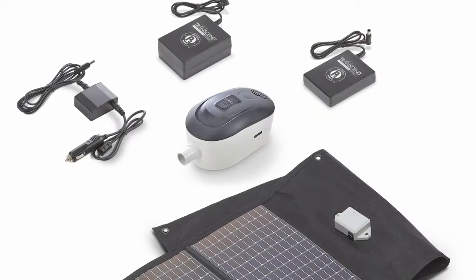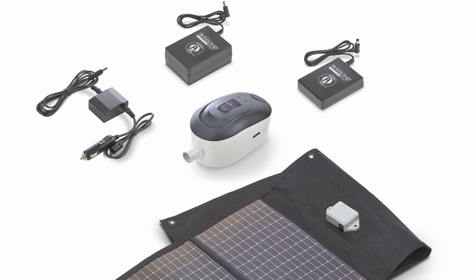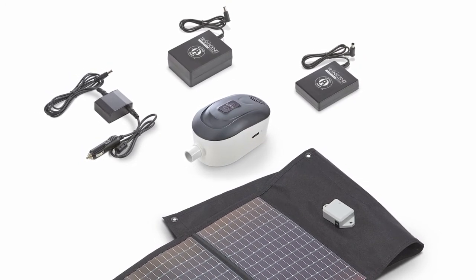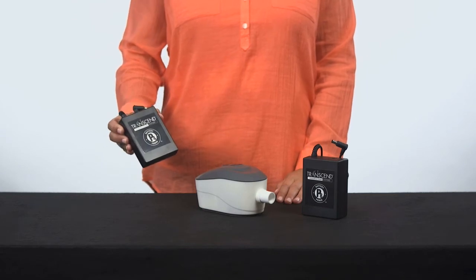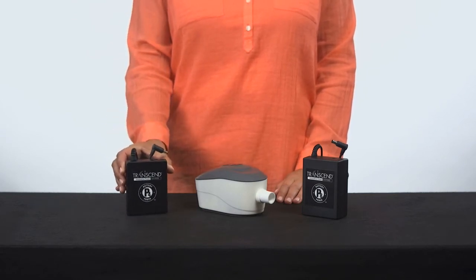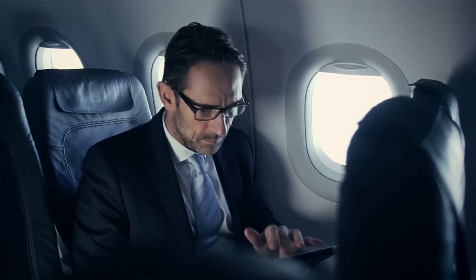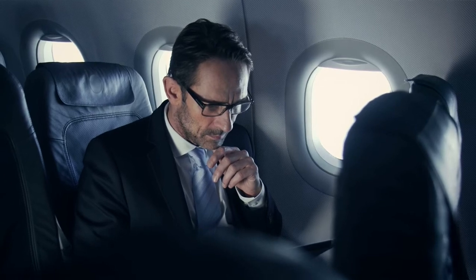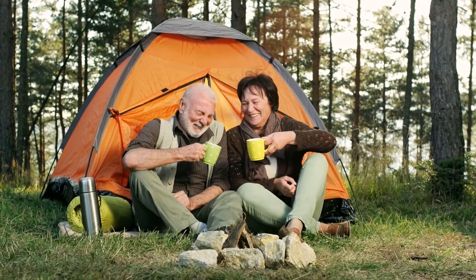With more power options than any other CPAP, the Transcend 3 is the most versatile portable CPAP in the world. The small but powerful P4 and P8 batteries are perfect for overnight stays or as backup power during outages. You can even use your Mini CPAP on your next flight. With the DC mobile power adapter and solar battery charger options, you can even sleep off the grid.